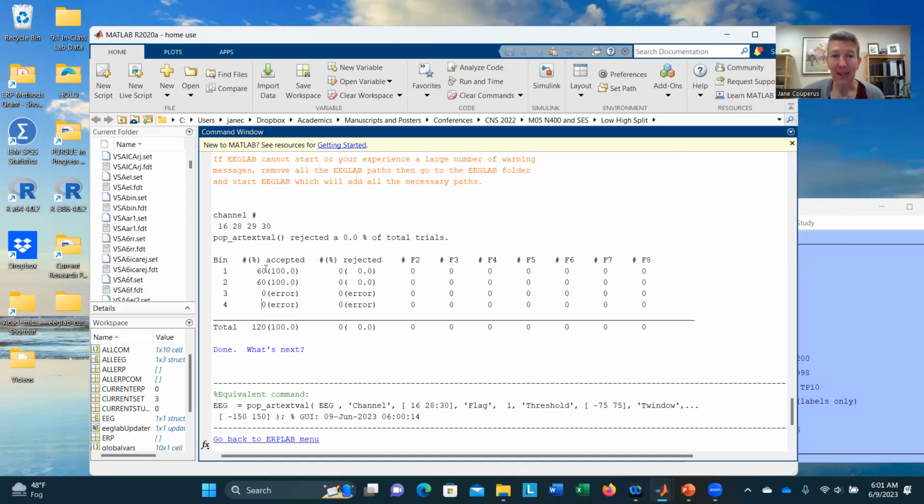In this case, 100% of those trials were accepted and none were rejected, which suggests that people just didn't blink when the stimulus was on the screen, which is a great thing, right? That's what we would like to have happen.